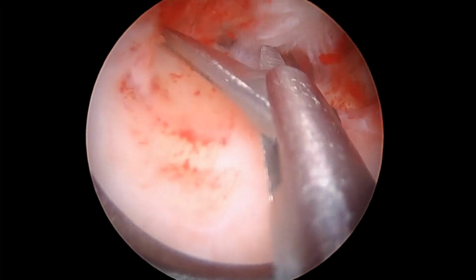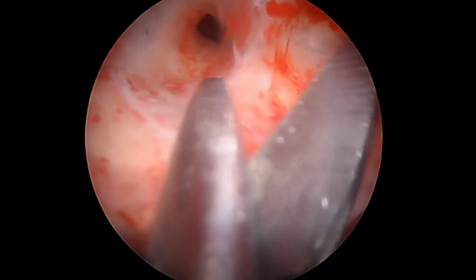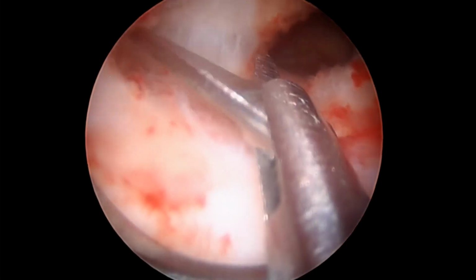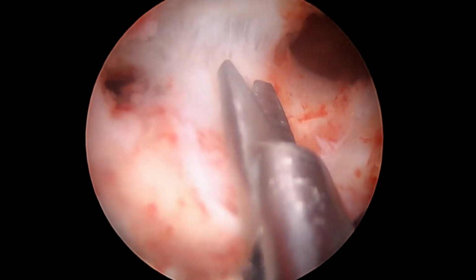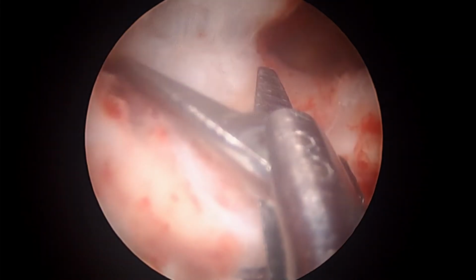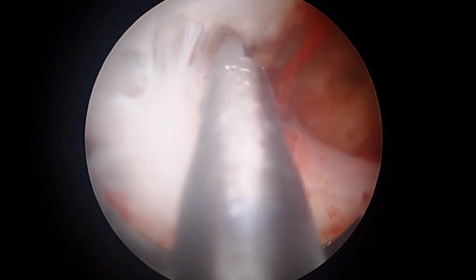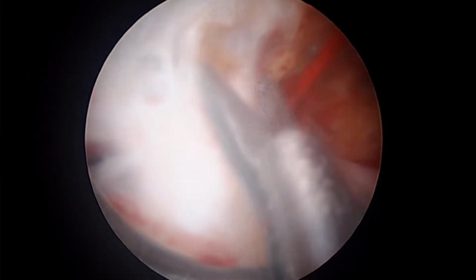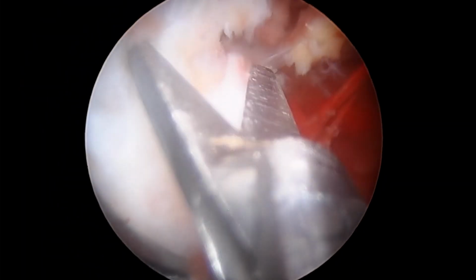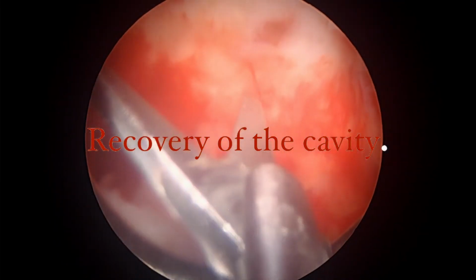You can see we nearly have a cavity recreated in this patient, but you can also clearly see that the aggressive evacuation caused excessive fibrosis with endometritis, and recovering this endometrium is not very easy. Sometimes you need to do repeated surgeries to take care of the recurrences.